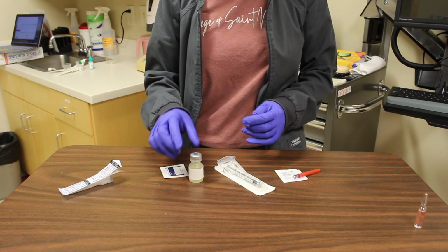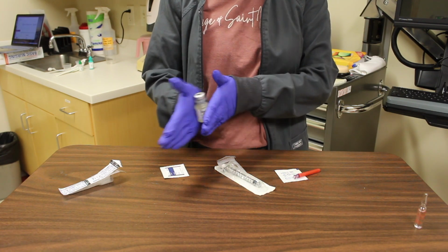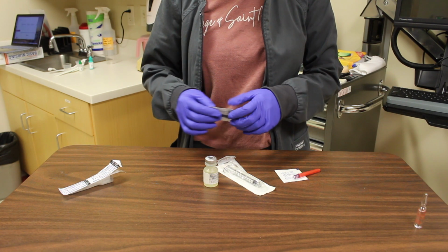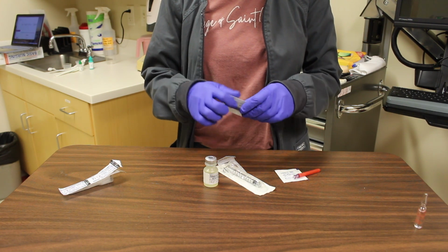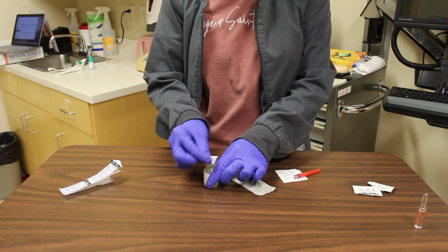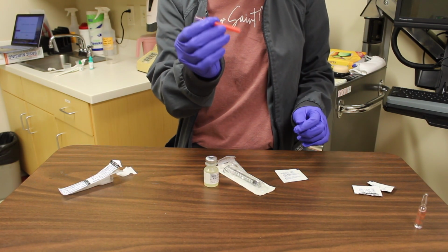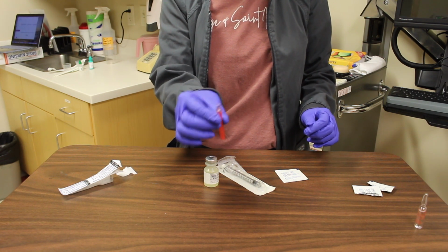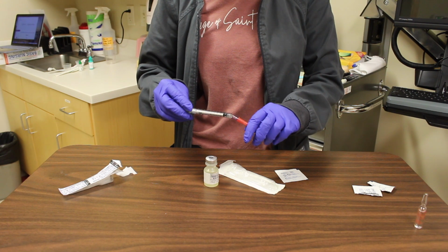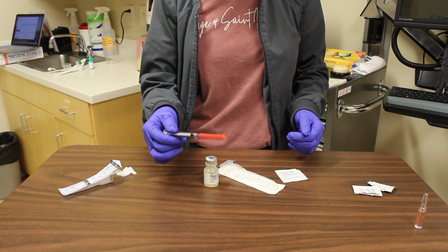To draw up medications from vials, mix the solution in the vial by rolling in between the hands, if necessary for the medication. Place the vial on a flat working surface. Scrub the rubber top with an alcohol wipe. Ensure that you are using a blunt needle, aka a vial access device or a VAD, and attach that needle to the syringe that you will be using. A blunt needle is one that is used only to draw up medications, not to administer the medication.